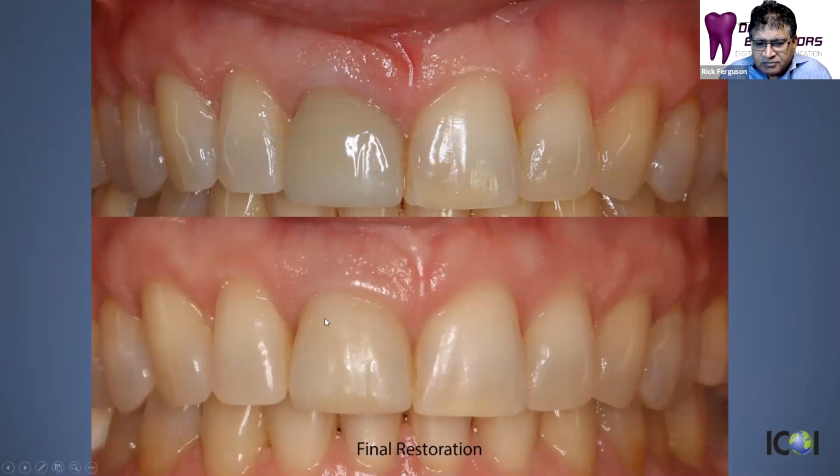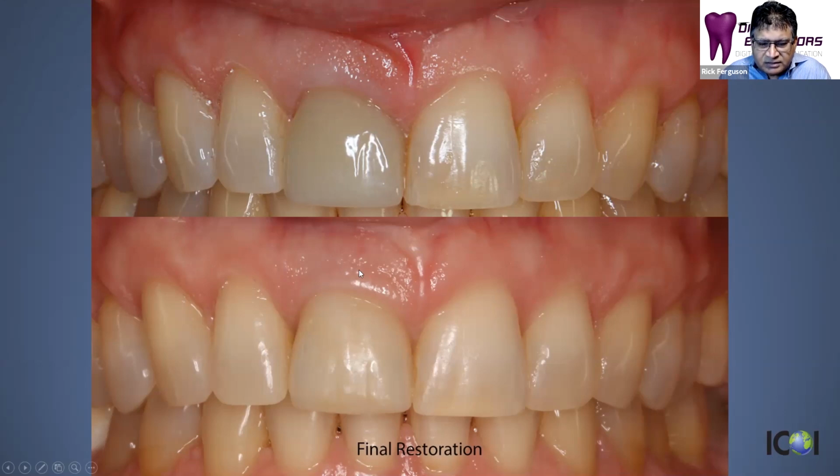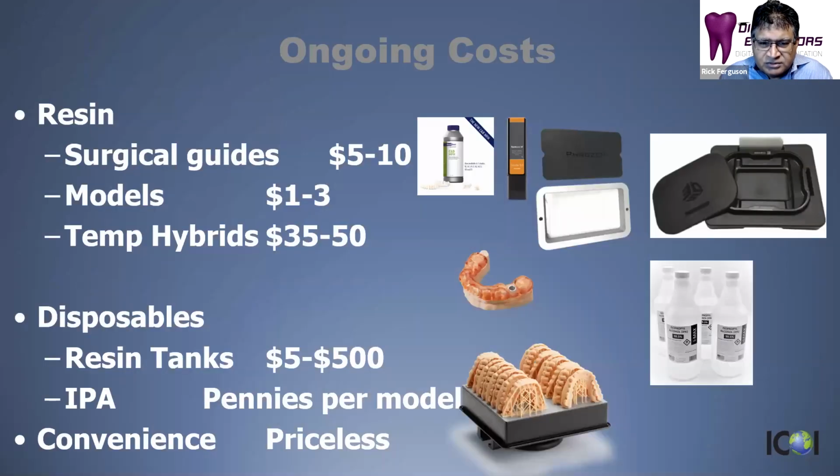And if we look at the final restoration, how we were able to preserve the tissue contours of the original tooth that was in place. Now we could go back and do a little bit of laser recontouring here to make both of these ideal, an equal shape. But frankly, the patient was very happy with the result. And I even showed her how the tissue looked exactly like she had on her previous tooth. And she was very happy with the result here.